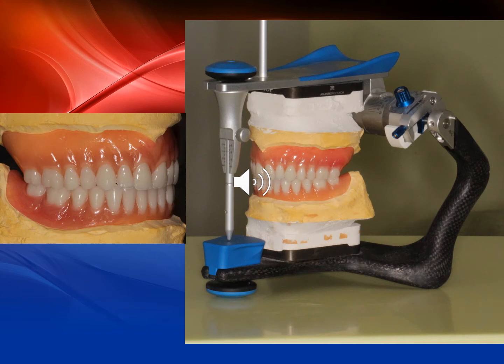The articulator has an anterior element, which is the incisal pin that is sitting on the incisal table, and two posterior condylar elements, in which the condyles attached to the lower member are related to the condylar housing of the upper member in a similar way to which the mandibular temporomandibular joint is related to the glenoid fossa. We try as much as possible to make the movement in this articulator simulate the movement inside the patient's mouth so that this movement can be rehearsed, and according to which the occlusal relationship between the upper and the lower models could be adjusted so as to have no interference inside the patient's mouth.